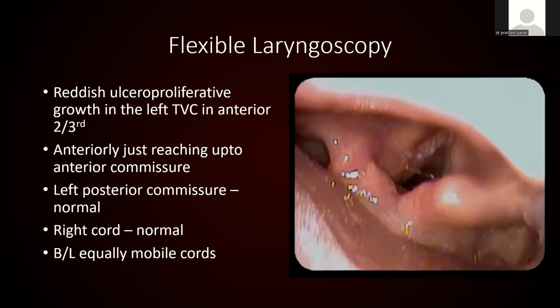Most importantly, you would want to see whether you are able to suspend well. Correct. So that whenever later you plan a laser procedure, you already have the information. Correct.